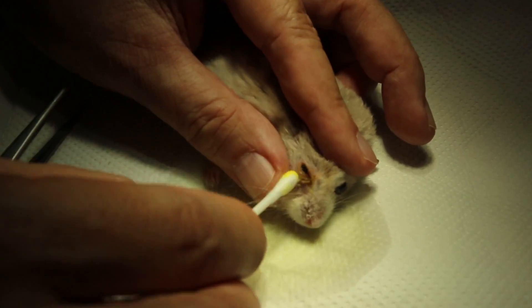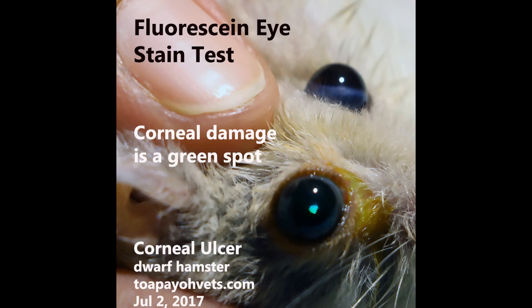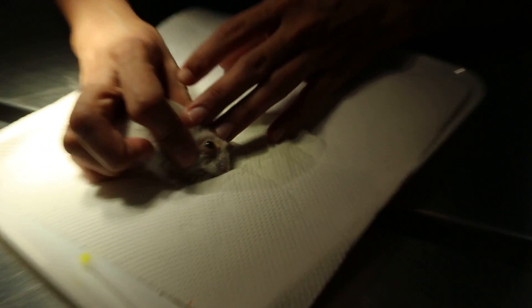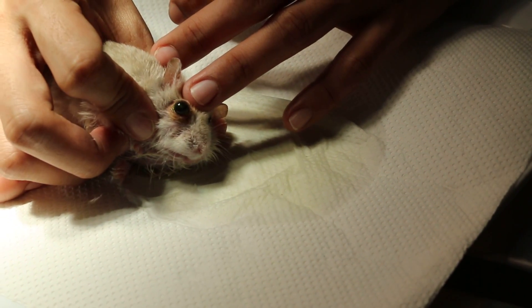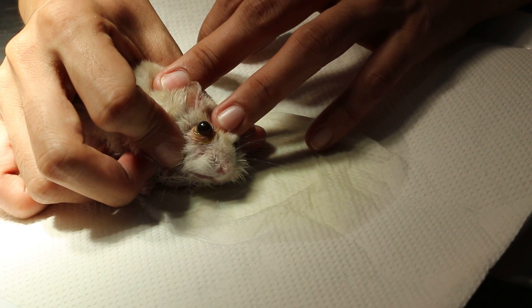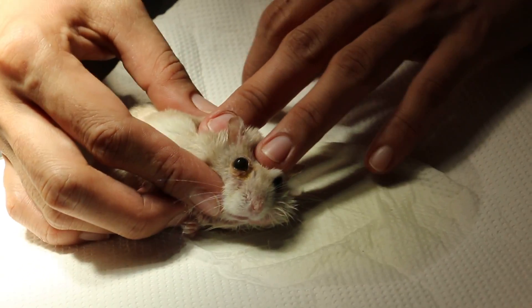Sometimes you have to focus on far. It's a very obvious one and very central, like in dogs. You can't see it well on camera. Put the whole head on the table — don't put it upwards, because this camera cannot focus. The face should not be elevated. So this green ulcer is about 2mm.